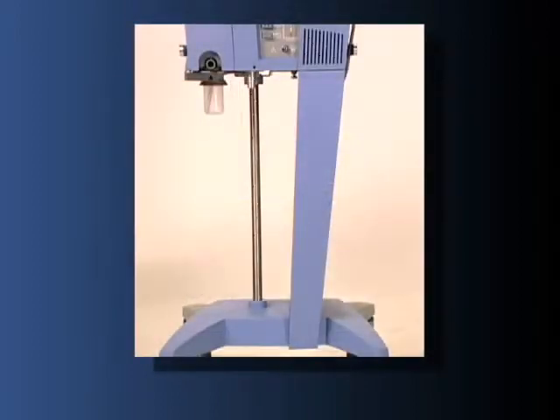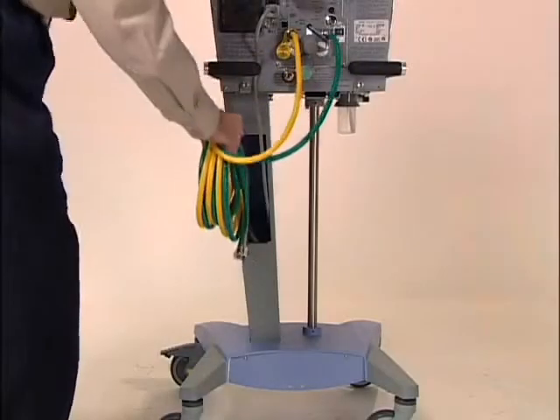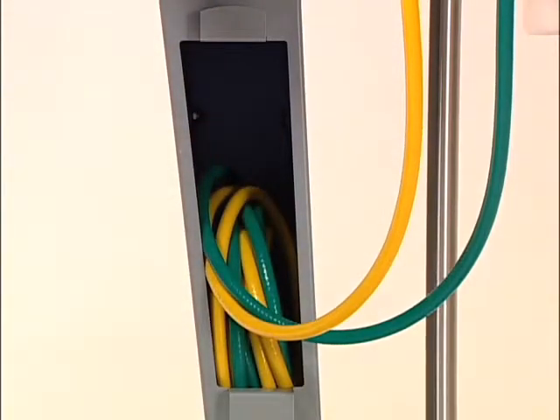Active humidification systems can be attached to the pole portion of the cart with a standard pole mount. High-pressure gas hoses can be conveniently stored in the rear compartment of the comprehensive model cart.